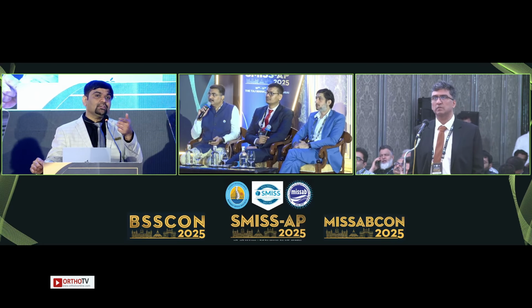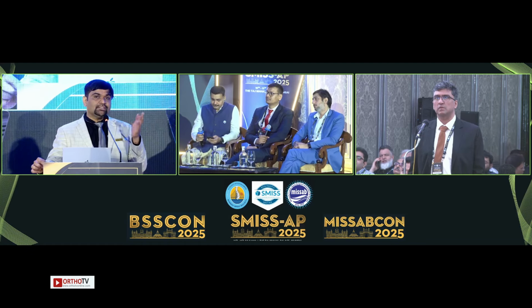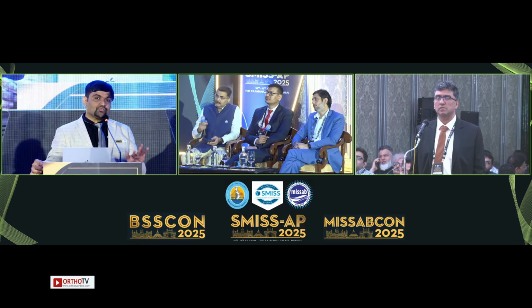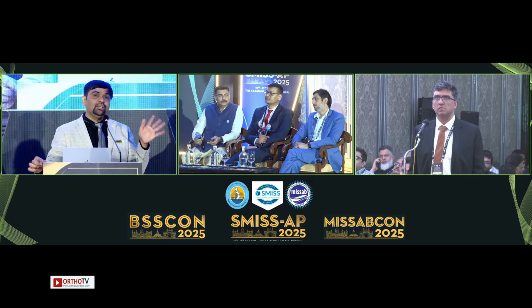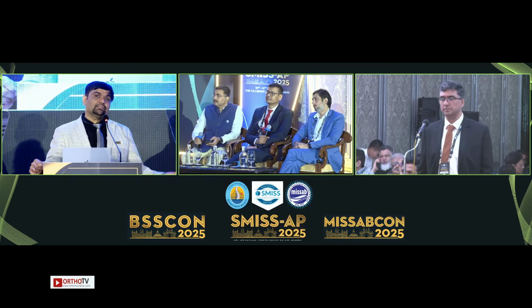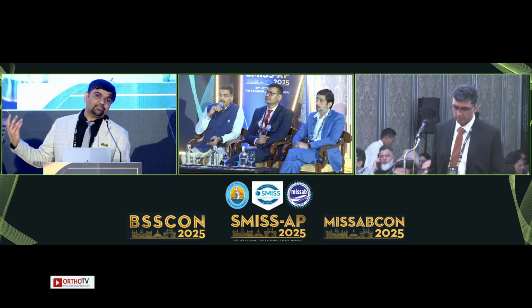But when you are dealing with a calcified disc at a lower lumbar level, you should try to remove the calcified fragment as far as possible. At a higher lumbar level, you just need to decompress both roots. Otherwise, you may end up with neurological consequences. At a higher level, don't attempt to remove a calcified disc.